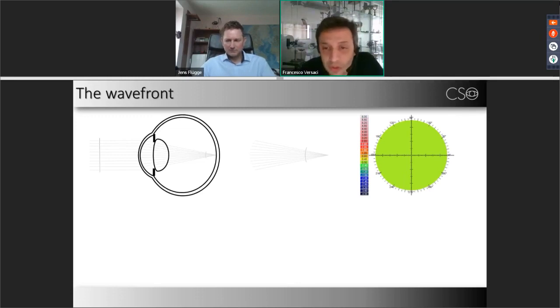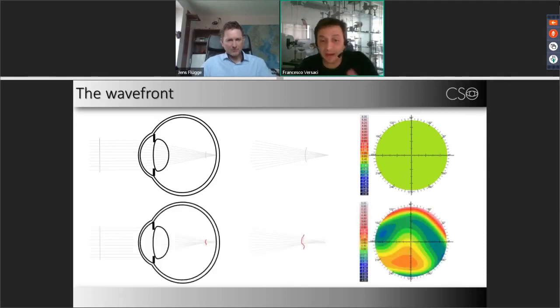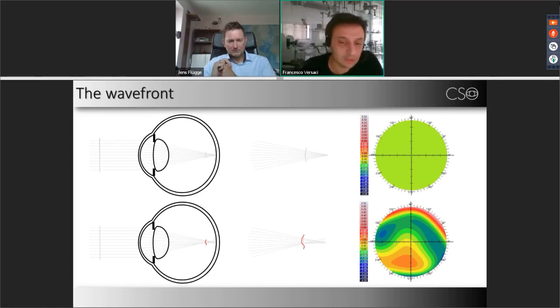If you observe this picture, the only surface that is always perpendicular to the rays is a spherical wavefront. But if we define an aberrated bundle of rays, we cannot have this condition anymore, and so this wavefront, this orthogonal surface, differs from the sphere.